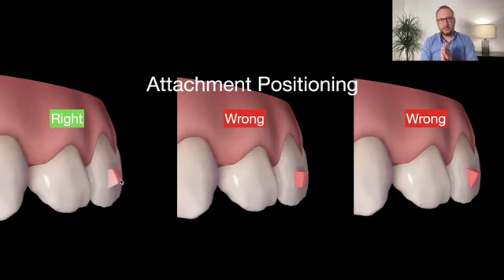When we would place it down, like we are seeing here, if the force is coming up, right? But against this force, we have the whole crown and the whole plastic holding there, and we don't need a surface, okay?